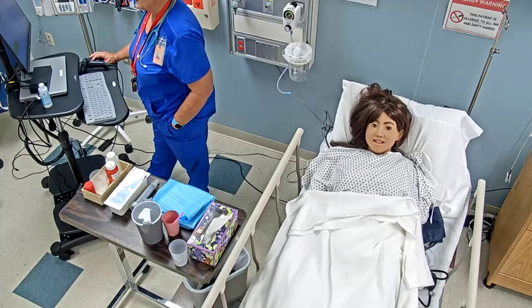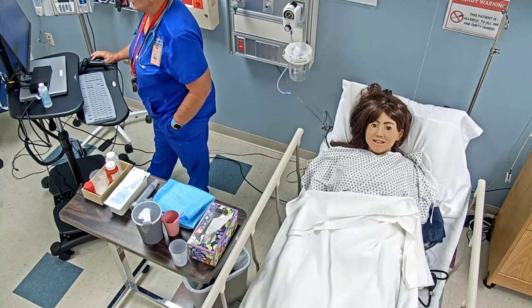And I've got Anna Taylor, date of birth 4/24/1991, no known drug allergies. And I have metoprolol 100 milligrams daily per peg tube. And this one is scheduled at 9 o'clock. So that is correct. So I'm going to go back to my doctor's orders. Anna Taylor, date of birth 4/24/1991, no known drug allergies.